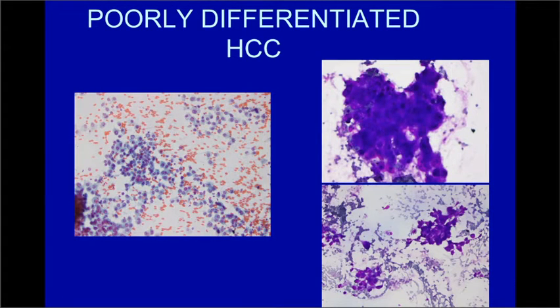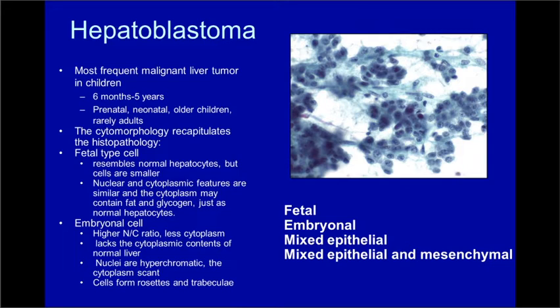And hepatocellular carcinoma shows varying degrees of differentiation. I showed you mostly well-differentiated hepatocellular carcinomas, which might be difficult to diagnose. Moderately differentiated carcinomas are easier to diagnose both as hepatocellular and as malignant. When we get into the area of poorly differentiated carcinomas, which might only have a dispersed cell pattern or very significant pleomorphism, it's going to be more difficult to recognize these cells as hepatocellular in differentiation. And then the differential diagnosis is going to be with other malignancies, such as even possibly cholangiocarcinoma or metastases.